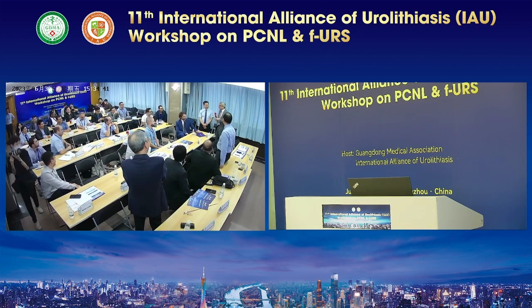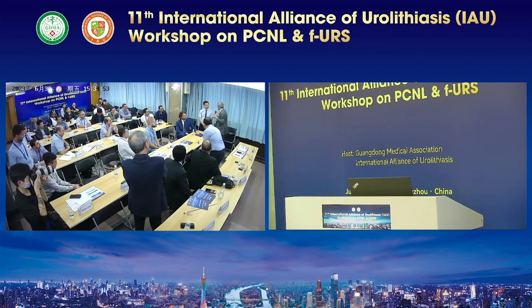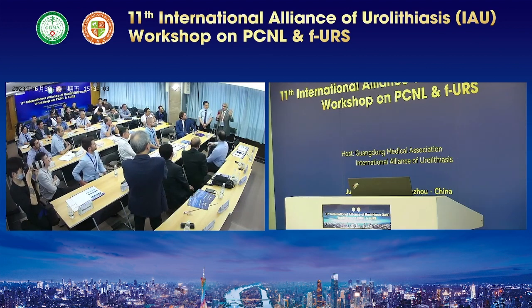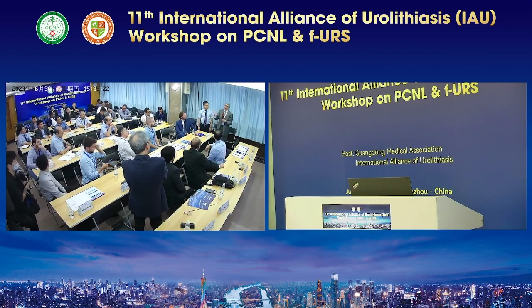Here in China, his approach is first a large bore tract, and then additionally a combination of small bore tracts, but PCNL, nothing else. Is that right? Yeah, that's right. But if you go to Europe, they say, if possible, don't puncture. Go from below, if possible. Otherwise, puncture once, get the main stone burden out with one tract, and then endoscopic combined for the calyceal stones, residual stones, with a flexible approach. Europe, China. What do you say?